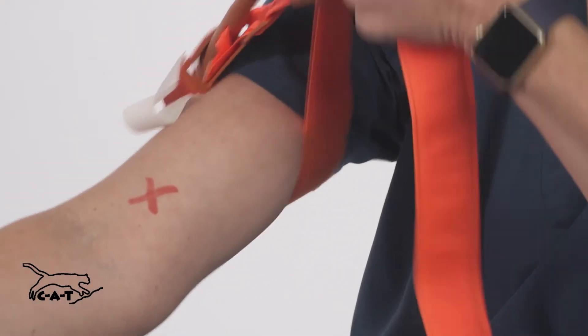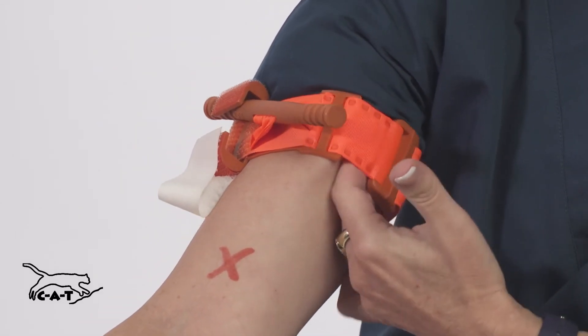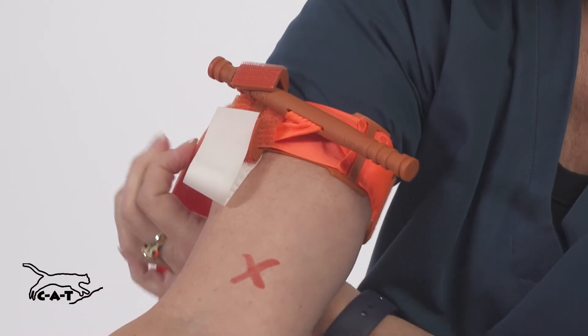Pull the band tight and back over itself, but not over the rod clips. Three fingers should not be able to fit under the band. If three fingers can slip under the band, retighten.